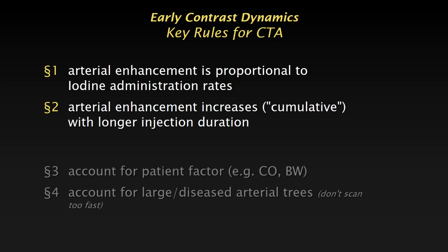It's a little more complex. It's in a cumulative fashion, because it adds up, all the different injections add upon each other. What stays relatively constant, though, is that the overall duration where you will have good contrast still correlates very well with the injection duration. No matter how each of these curves look, if they are spaced 4 seconds apart, the total width of your available opacification will stay the same.